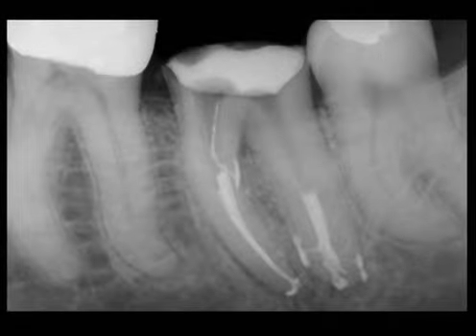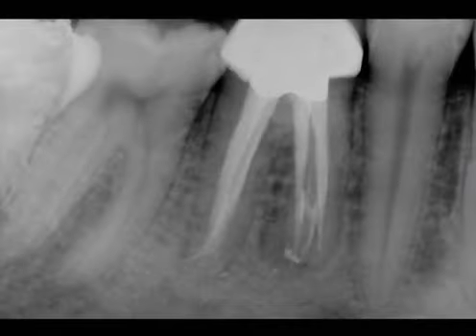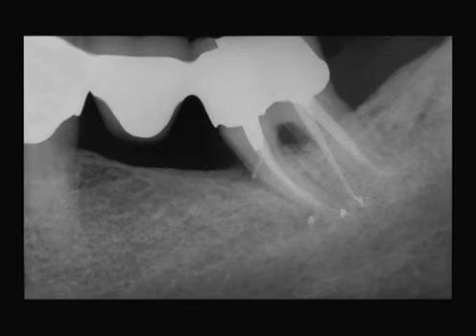Mandibular first and second molars routinely have significant variations within what has become known as normal anatomy. Clinicians need to check the mesial root for a third system, which is occasionally located within the groove between the MB and ML orifices, or it may be displaced. The broad distal root commonly contains an extra canal which may be separate along its length or become contiguous following the cleaning and shaping procedures.